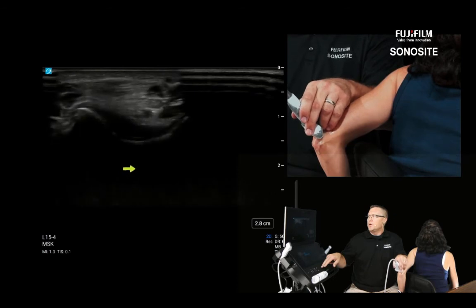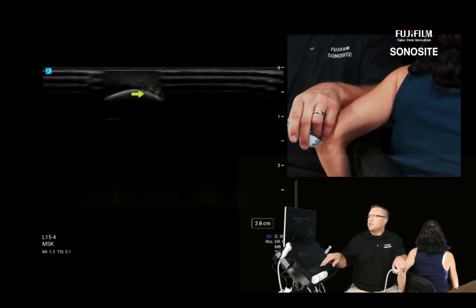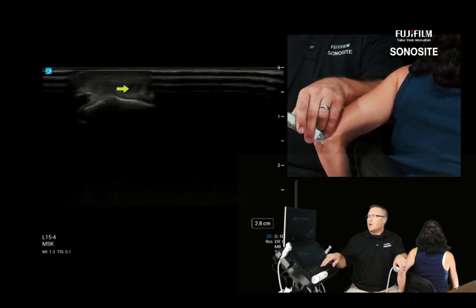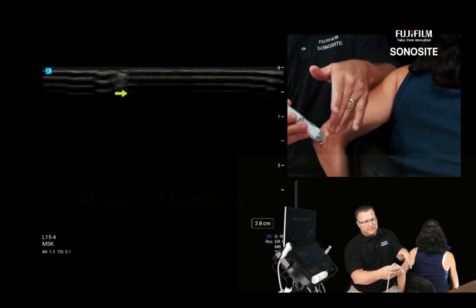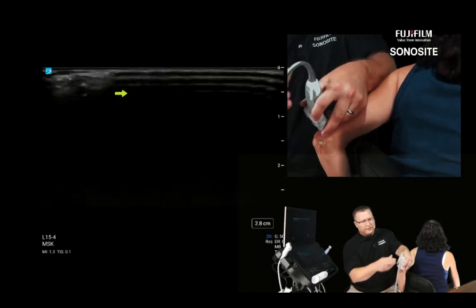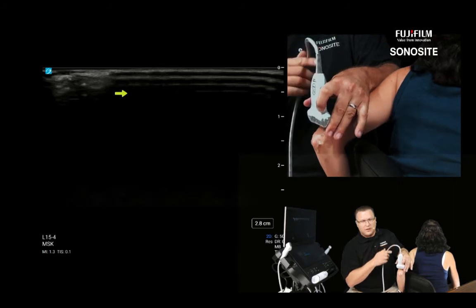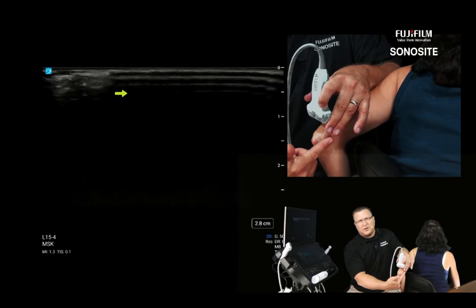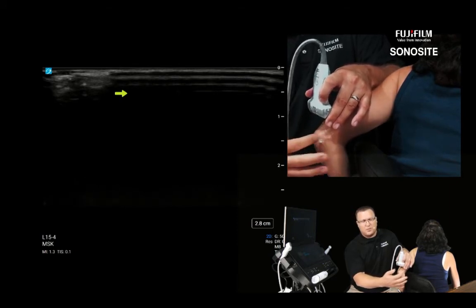Going more distal now, let's look at the enthesis of the triceps tendon superficially, checking out its integrity. While I'm in this area, I'll typically just slide the transducer medially, and I can feel with my fingers the medial epicondyle here. So what I'm going to do is use that as a pivot, and you can see my finger just hanging underneath the transducer right here, and it's just going to act as a pivot point and kind of a pressure stabilizer so that I'm not applying too much pressure on the medial epicondyle while I do this ulnar nerve exam.